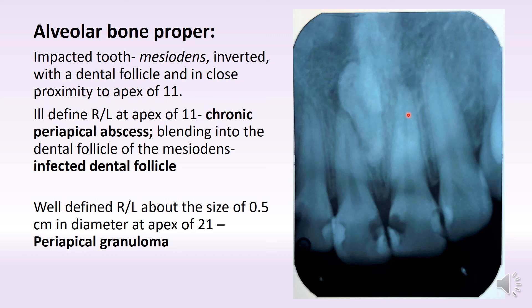And that is indicative of a periapical granuloma. So 1-1 is having an ill-defined radiolucency whereas 2-1 has a reasonably well-defined radiolucency.